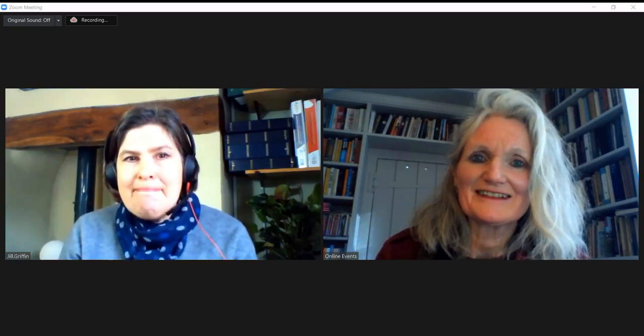That's T-scores. That's great. And I think, of course, as you've already suggested, what we know is that there is this close relationship, isn't there, Jill, between your bone density and your bone strength, what we call your risk of breaking a bone. So I guess it's the lower you are away from that average range, the greater your risk of breaking a bone. Is that a fair way of putting it? Yeah, that's absolutely right. So the closer you are to zero, the least risk. If it's a minus number and the further away you get from zero, the greater the risk.